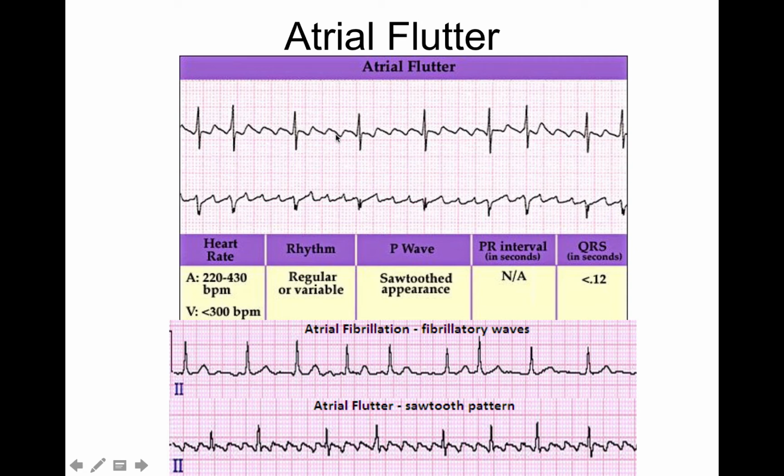And so this is where the atrias are beating really fast. And then the ventricles are saying, you know what? I can't handle you. I got to take a time out for a minute. So you can kind of beat, and then I'm going to contract when I want to contract. So every third impulse that you give me, I'm actually going to do something about it. So there is some variances that you're going to see.